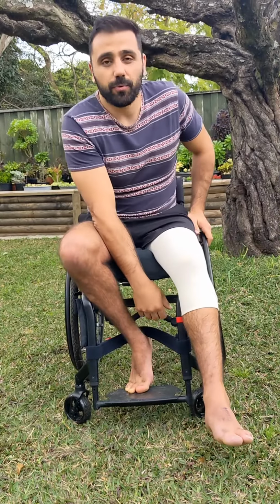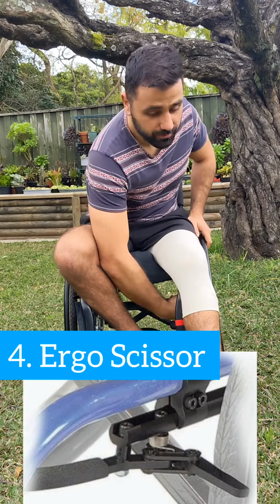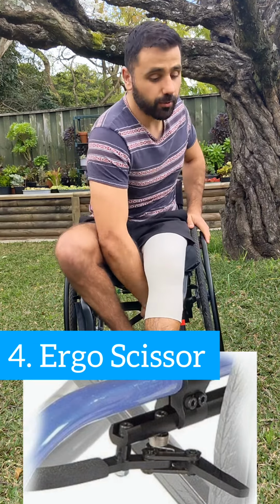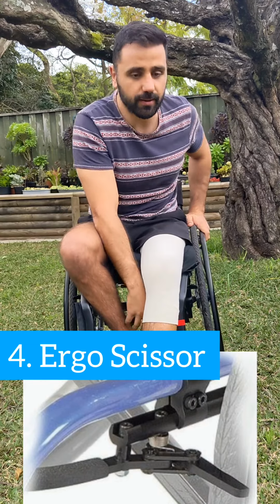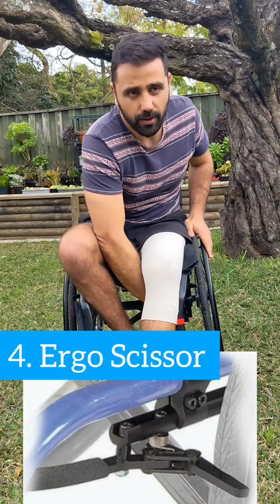A little uncommon type of brake is an ergo scissor brake, which is a brake that sits underneath the chair under here, and you essentially pull it and it locks a little lever that goes onto it. Now these are really good because you can get quite a lot of force and energy onto it, so you can get really strong brakes. But it does require you to have some hip range of motion to be able to get down and not have any injuries or anything going on over here that may impede your ability to go under your seat.